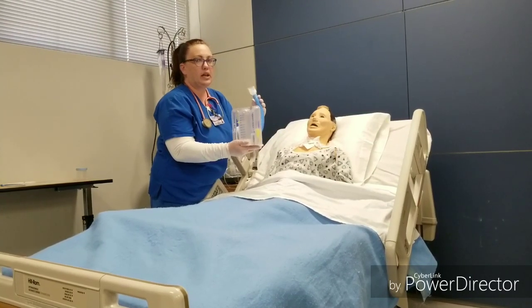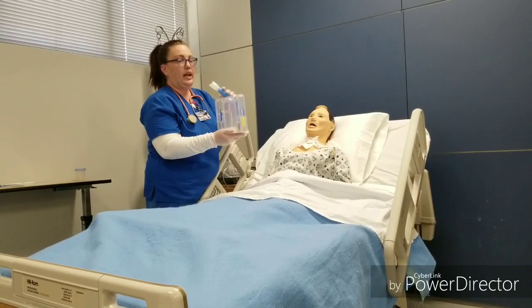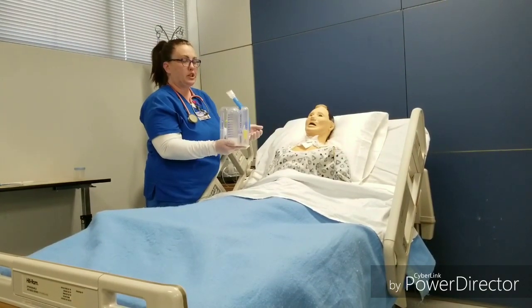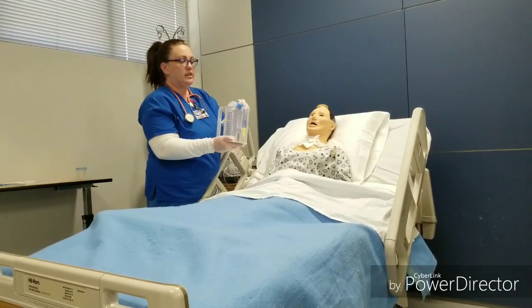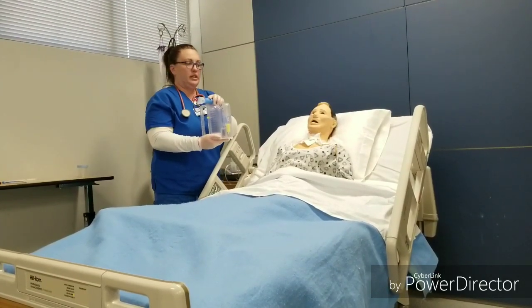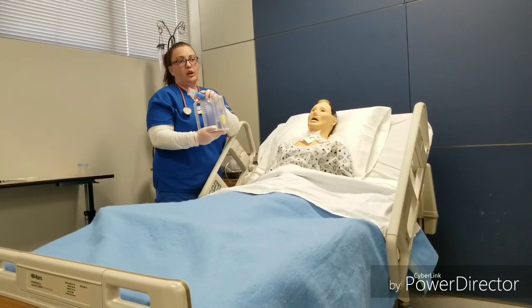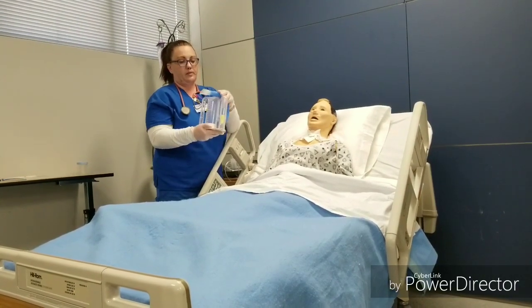And we're going to do this a couple of times to make sure that Mr. Smith understands how to do it and have him return the demonstration to you. And you will leave this on the patient's bedside table within reach and instruct them to perform this exercise at least 10 times an hour while awake.